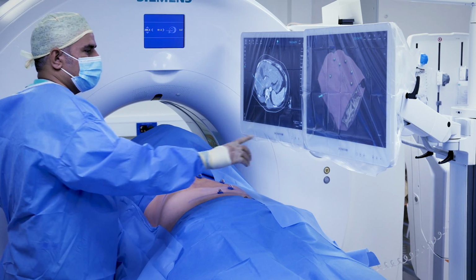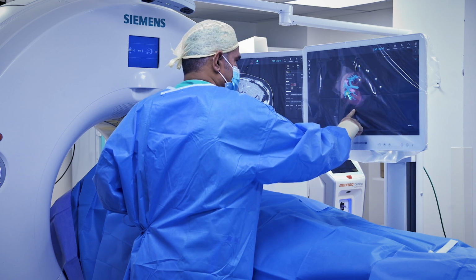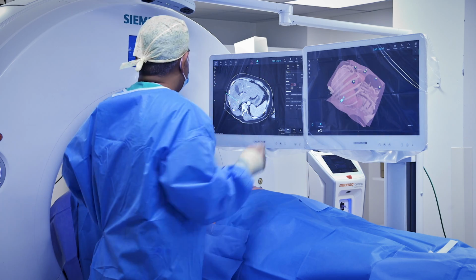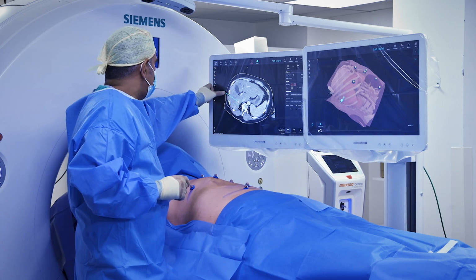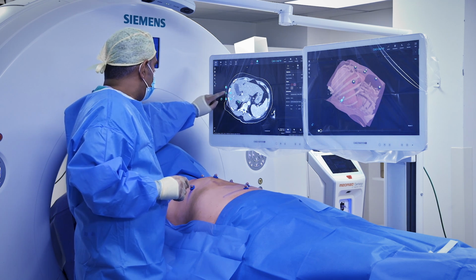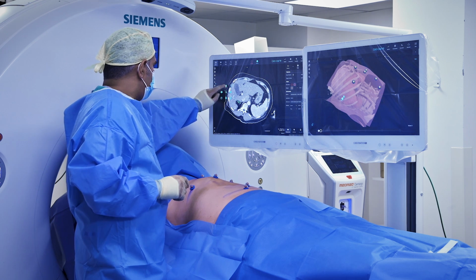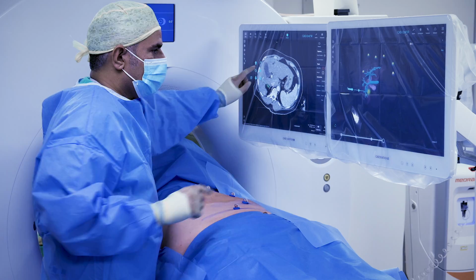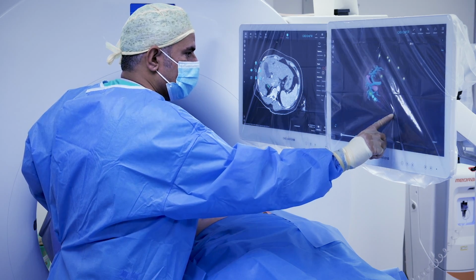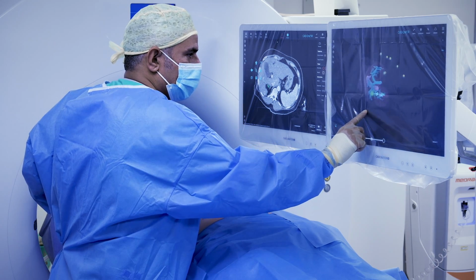If we go to the other screen now, there is a relatively small branch that may be potentially injured by the route that has been planned. So this is an example now where I might look to just slightly change the entry point, perhaps to something a little bit more vertical. What we will now see is that we're missing those branches and heading for the tumour there without injuring any significant vascular structure.